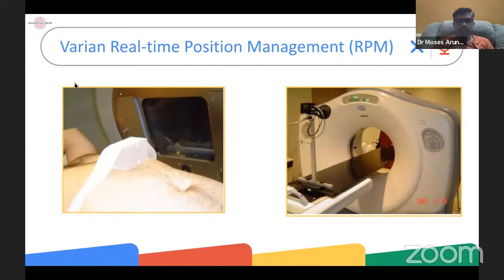If someone is very thin built and the aortic pulsations are being transmitted onto the plastic box, then you may have to keep the plastic box off center as well. If you are thinking of using a technique wherein you want respiratory monitoring constantly, monitoring during treatment delivery as well, then you will need to keep this box during treatment also.